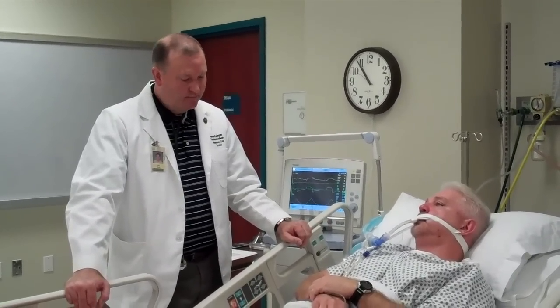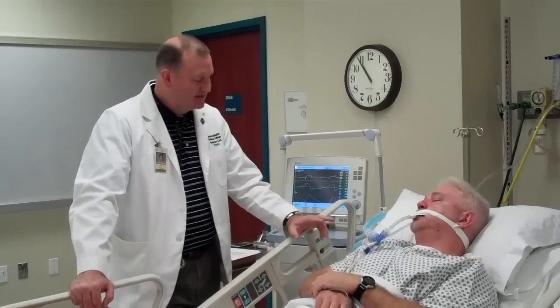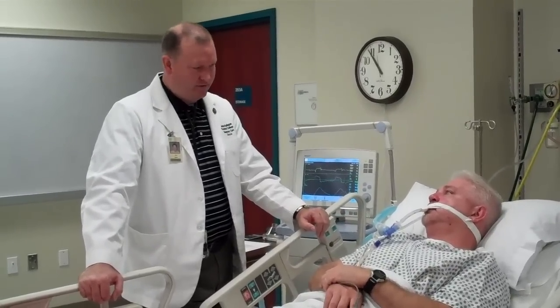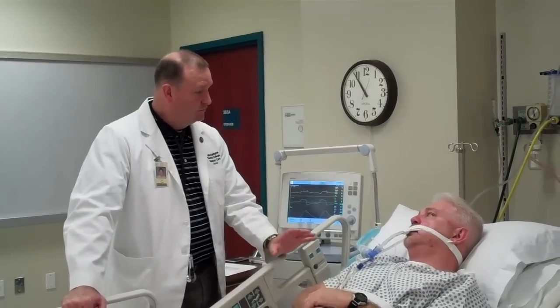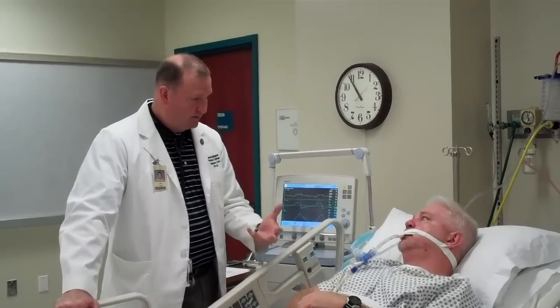So the first thing we'll do here is we'll talk to our patient, explain what we're doing and why. Mr. Dunphy, this next test that we're going to do is going to measure how strong your breathing muscles are. That's important because whenever we take this tube off and take you off this ventilator, we want to make sure that you have the ability to take a deep breath and cough and clear your lungs, okay?